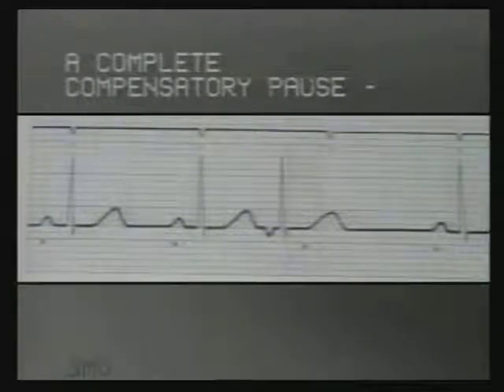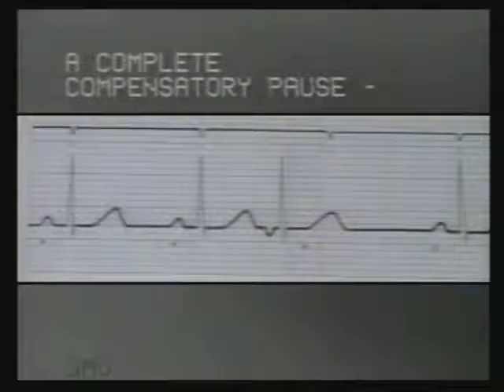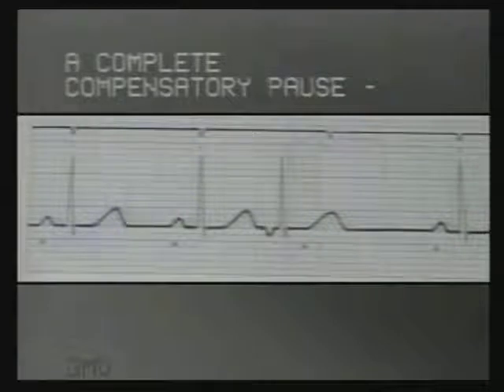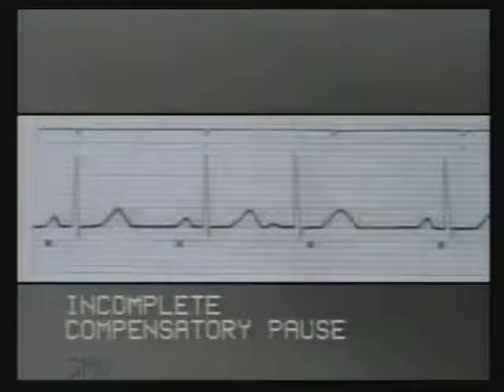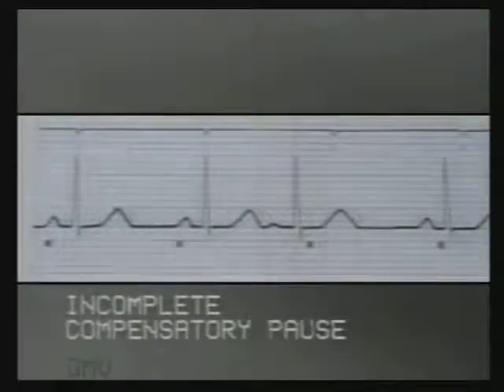Observe this tracing carefully. The red spots mark the expected occurrence of P waves and the black line at the top marks the expected occurrence of the R waves, that is, if the sinus rhythm was undisturbed. You will note that the beat after the premature beat has occurred exactly where it should have occurred — so this is a complete compensatory pause. In contrast, in this tracing, the beat after the premature beat has occurred before the next expected beat, so this is an incomplete compensatory pause.